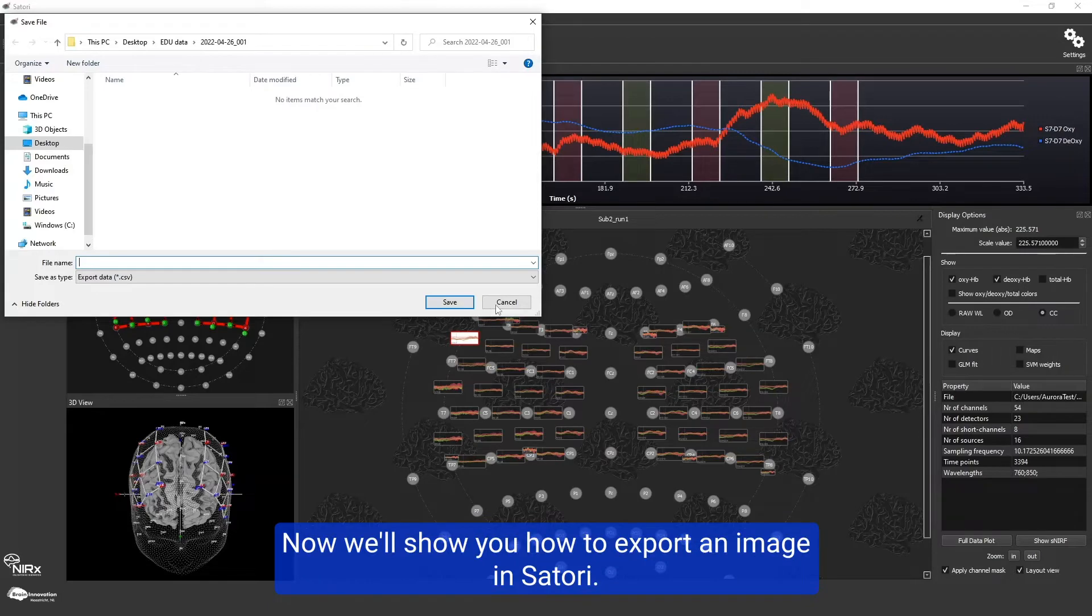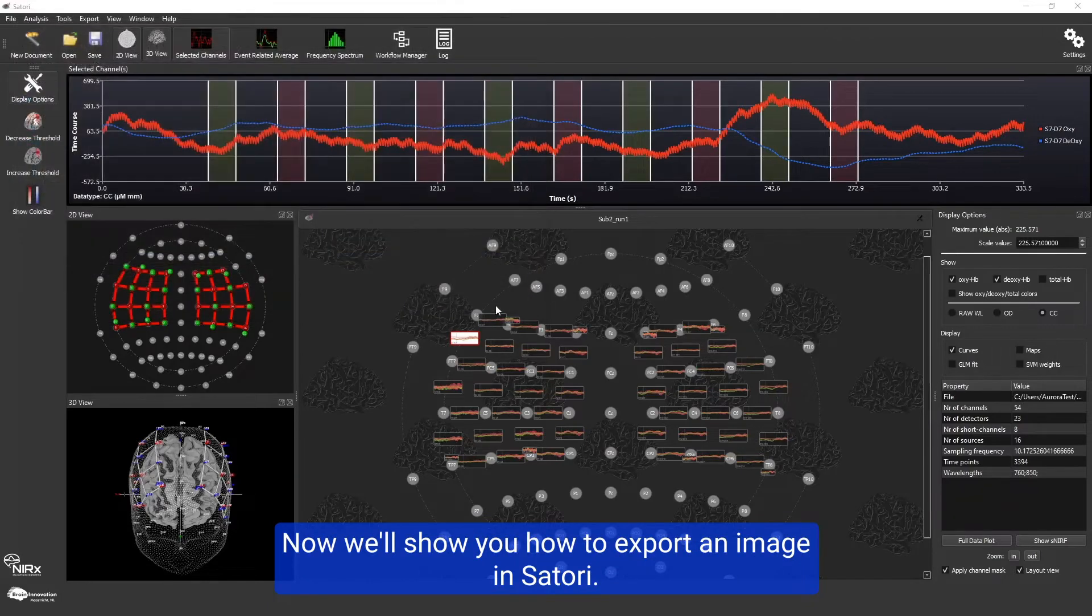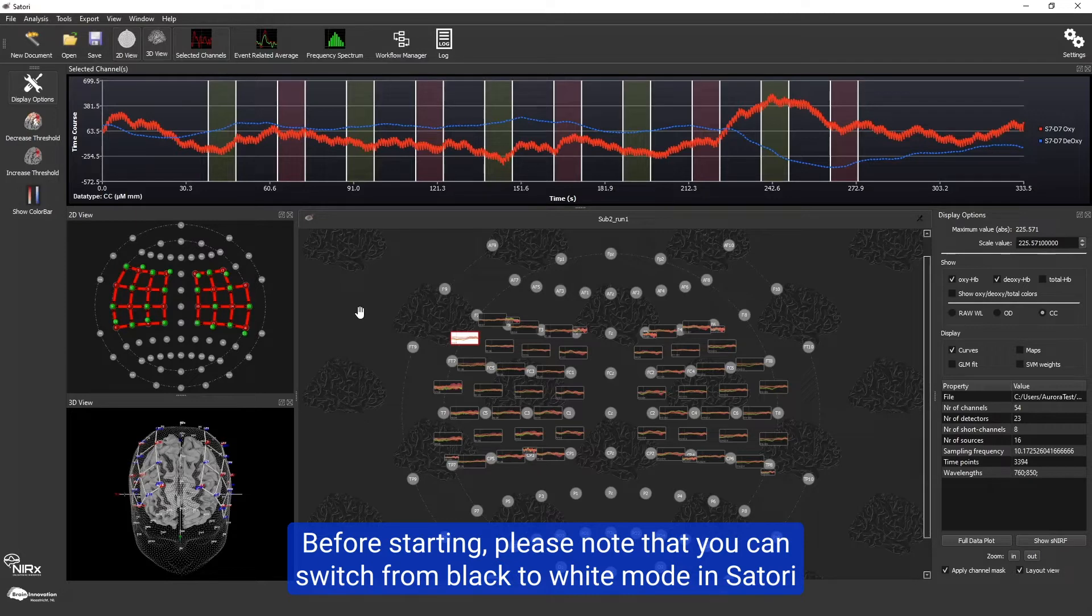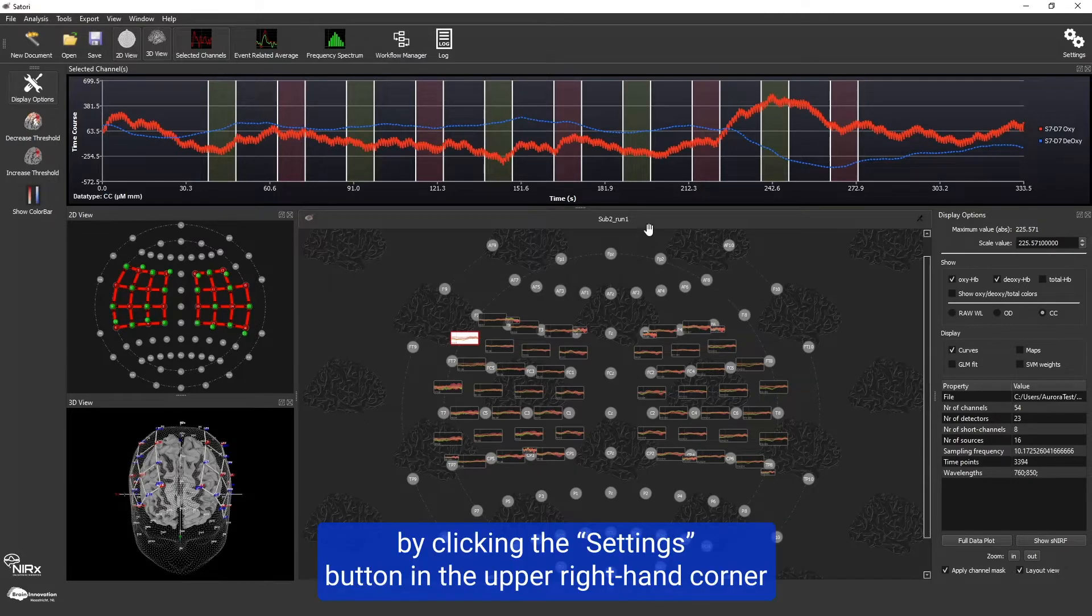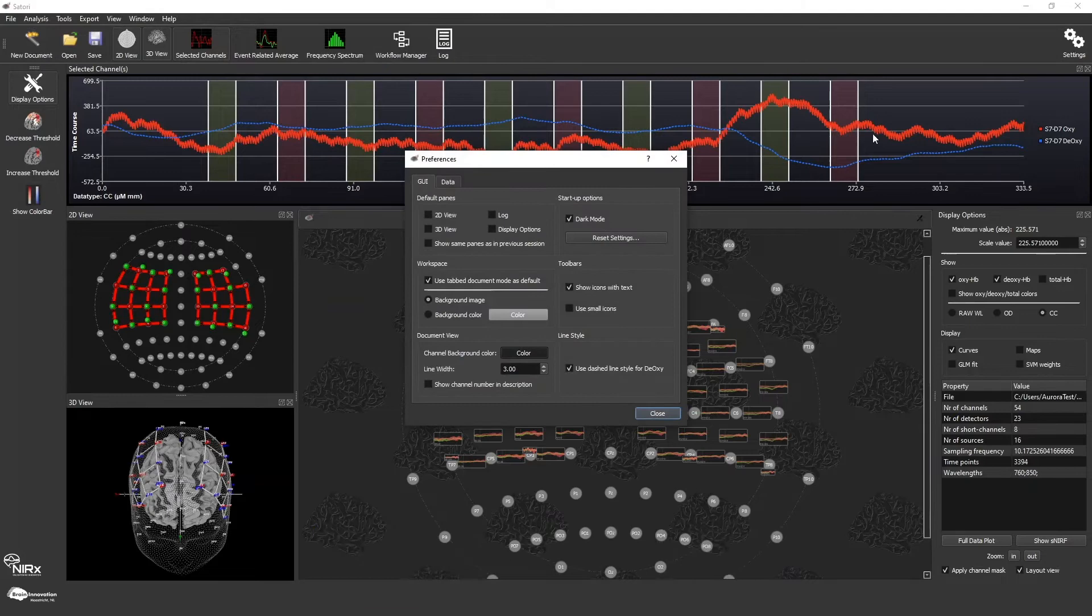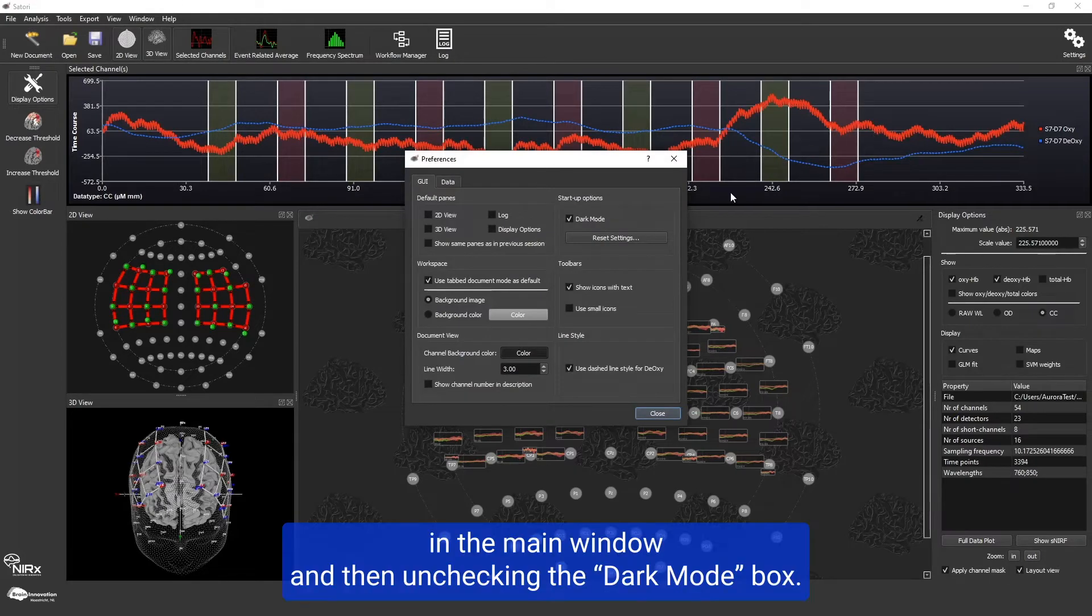Now I'll show you how to export an image in Satori. Before starting, please note that you can switch from black to white mode by clicking the settings button in the upper right corner of the main window and then unchecking the dark mode box.